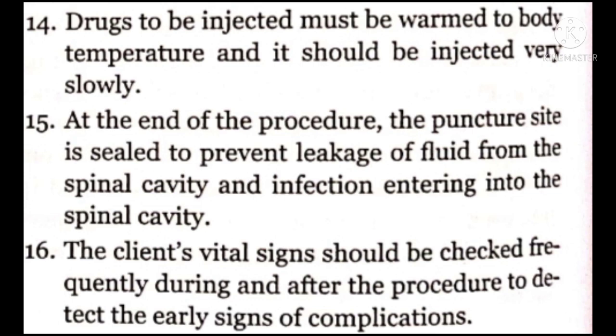15. At the end of the procedure, the puncture site is sealed to prevent leakage of fluid from the spinal cavity and infection entering into the spinal cavity. 16. The client's vital signs should be checked frequently during and after the procedure to detect the early signs of complications.